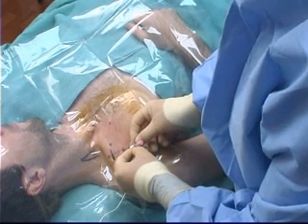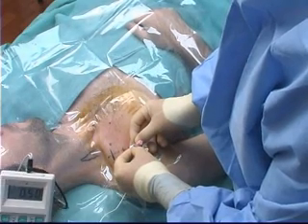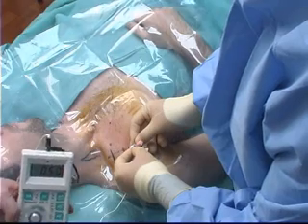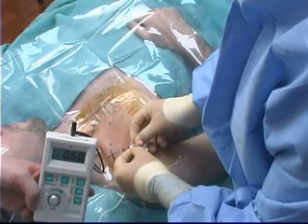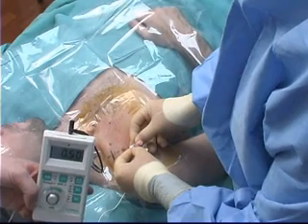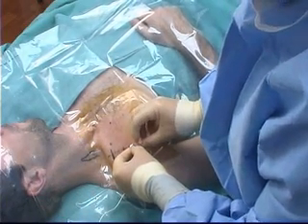When the appropriate cord of the brachial plexus is encountered, the medial cord in this case, the nerve stimulator output is turned down to between 0.3 to 0.5 milliamps. This confirms accurate needle placement, but it does not guarantee accurate catheter placement.